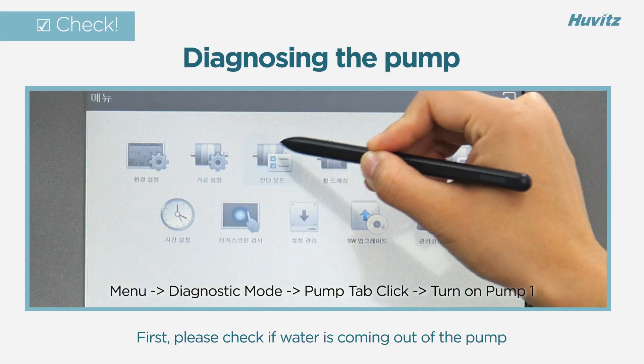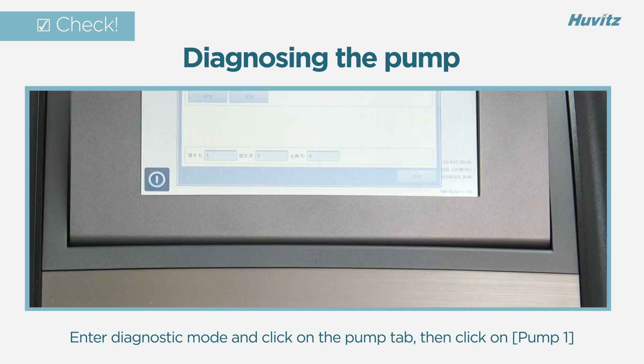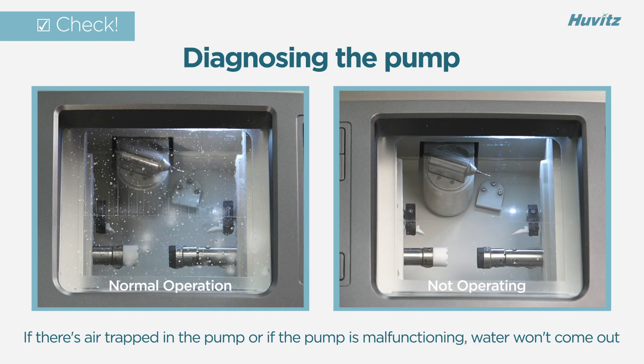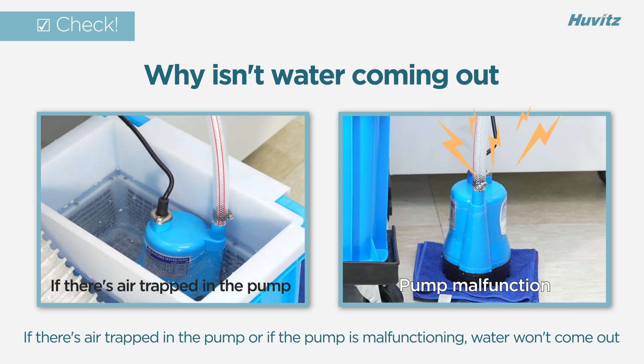First, please check if water is coming out of the pump. Enter diagnostic mode and click on the pump tab, then click on pump 1. If there's air trapped in the pump or if the pump is malfunctioning, water won't come out.